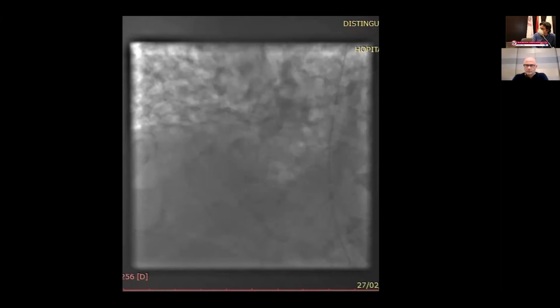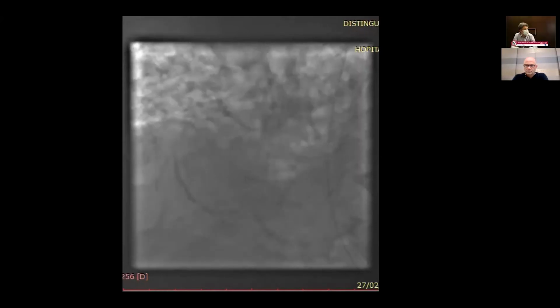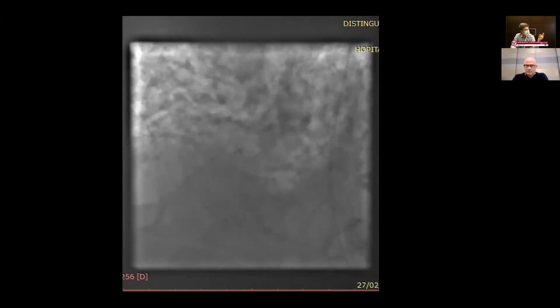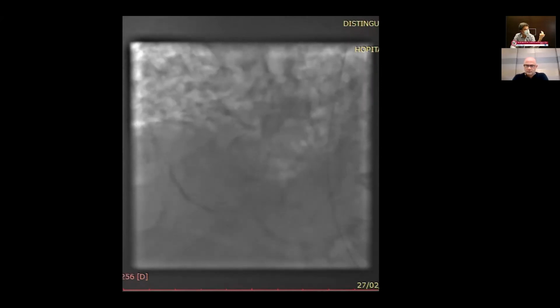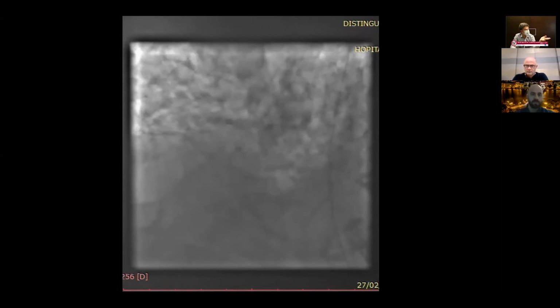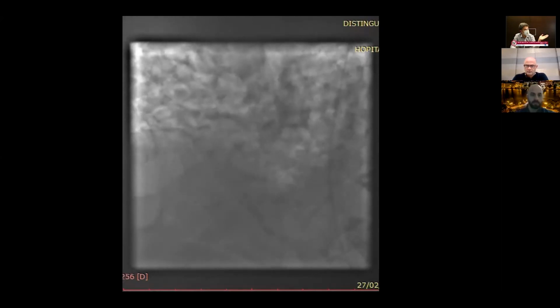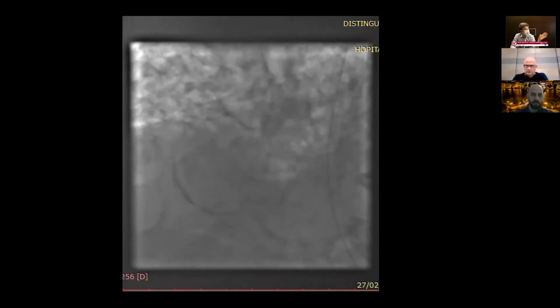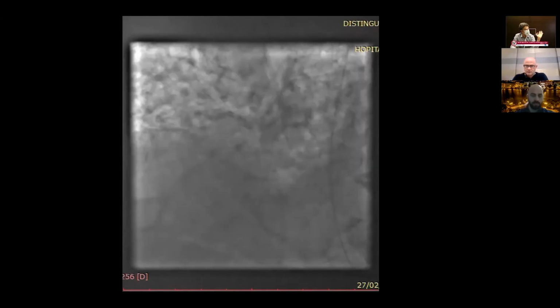Abdullah? Yeah, I think all of us have our eyes on that bit of linear opacity in the aorta. Obviously, sometimes you're so caught up in the lesion, you have to go back to the first shots to see if this was just calcium on the aorta or if this is contrast. But instrumenting the ostium of the right with the first guide and having difficulty, we can see this, and some mild dissection in the ostium, which at the end of the case, hoping it will be successful, all of us would stent the right coronary all the way to the ostium and have a clear conscience about this.